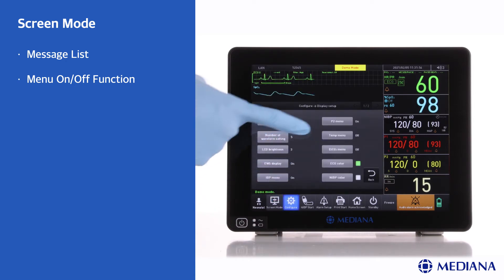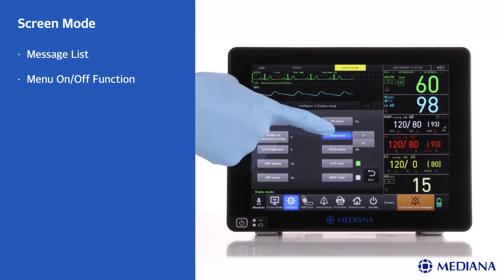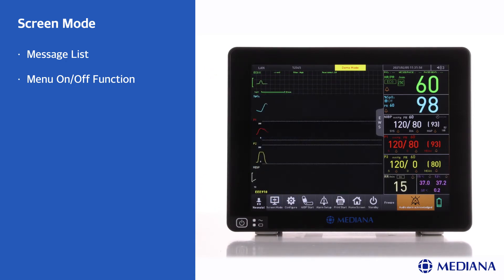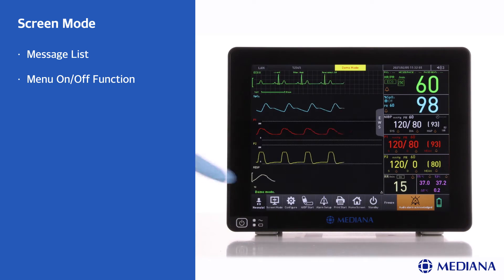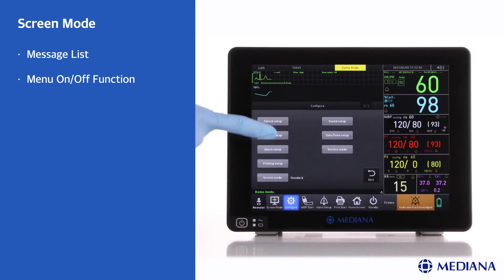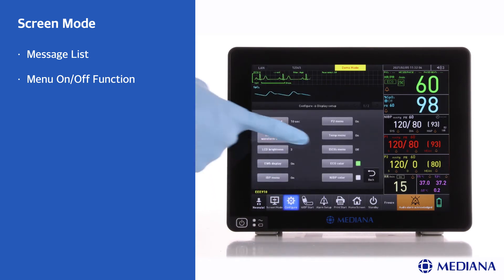It can be applied to early warning score, IBP, temperature and ETCO2.